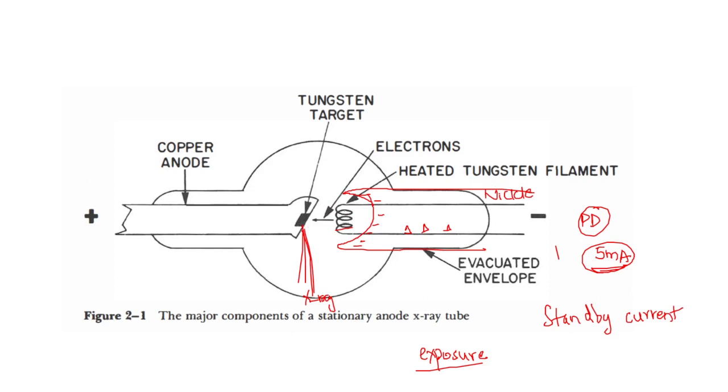Next, one more important thing is that when the tungsten is exposed to current for a longer period of time, it might become vaporized. The tungsten from the filament might get deposited onto the glass tube. When tungsten is deposited onto the glass tube, it produces a color, and this occurs as the tube ages. These aging tubes produce a bronze colored sunburn over the glass envelope. This produces two different effects. Number one, the X-rays produced at the anode get filtered by this bronze colored tungsten deposit.